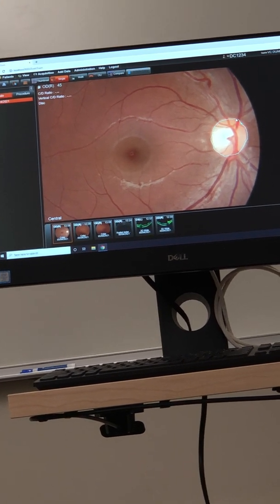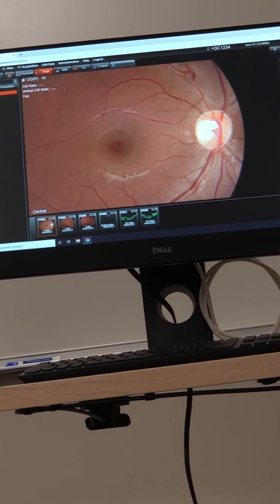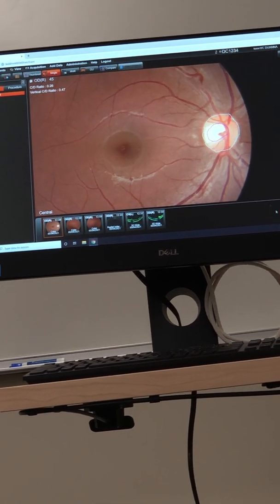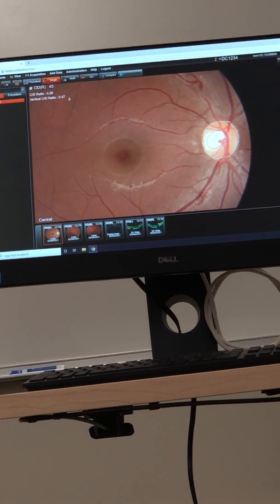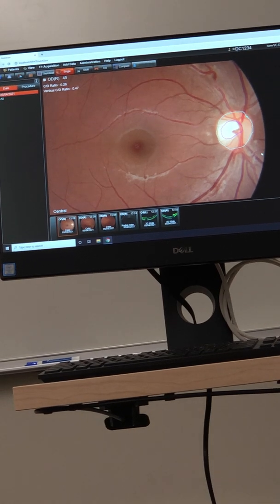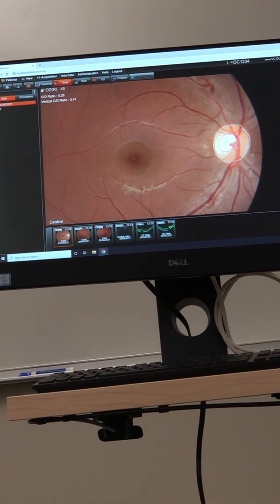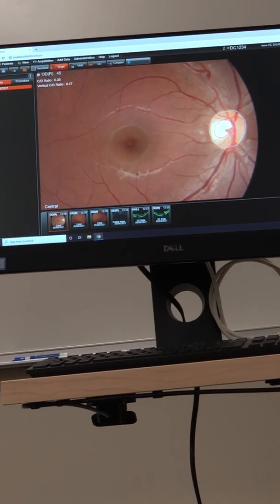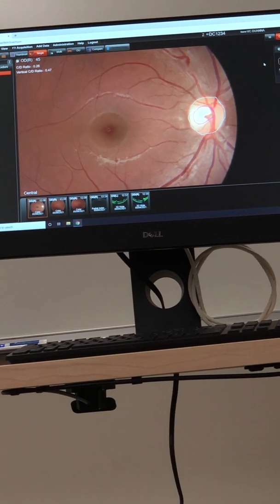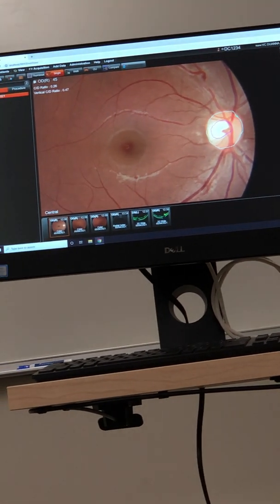This is where artificial intelligence would come in to actually gauge the cup to disc ratio without you manually drafting out the parameters. I mean, I really messed up, but 0.47, so it's 0.07 difference from the last time I did it. I was way off on this one. You get the point, and again, it is an estimation, it is subjective, so what you're looking at is for changes. When they're doing that with a glaucoma suspect, they're gonna be looking for changes in that CD ratio.